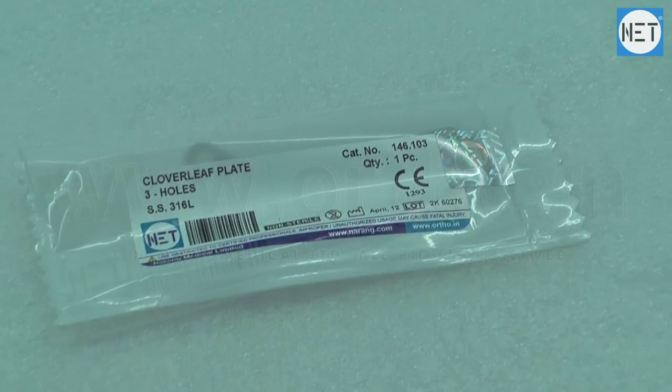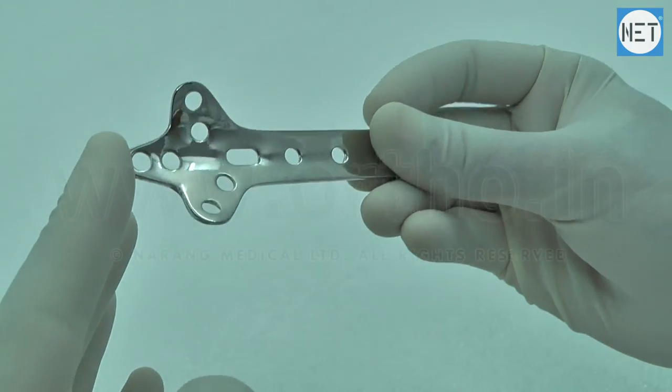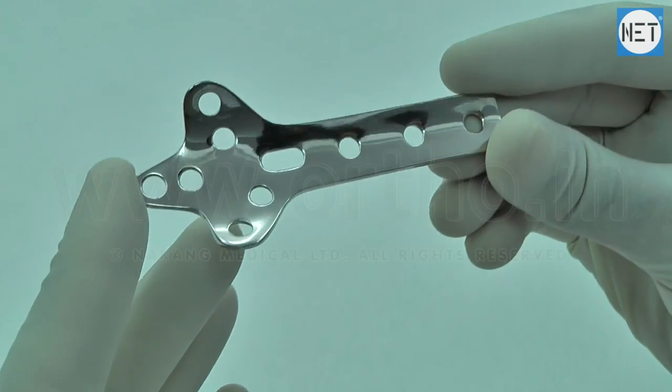Net Brand Clover Leaf Plates. These plates are indicated for the fractures of proximal humerus and distal tibia.